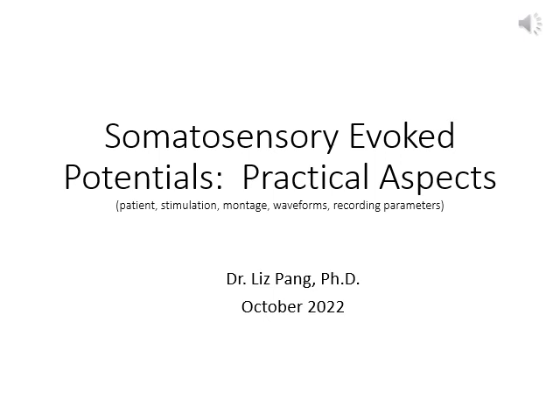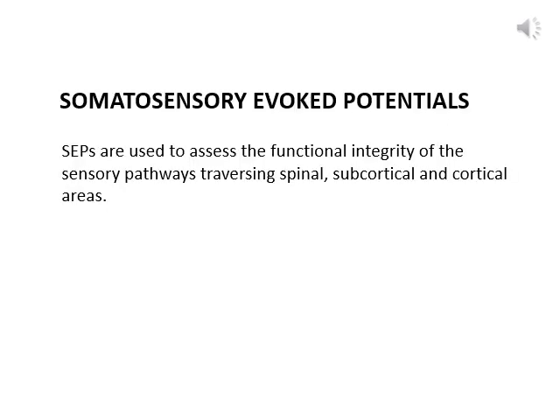This module looks at the practical aspects of somatosensory evoked potentials, and we will discuss patient parameters, stimulation, montage, waveforms, and recording parameters. Somatosensory evoked potentials are used to assess the functional integrity of the sensory pathways that traverse the spinal, subcortical, and cortical areas.